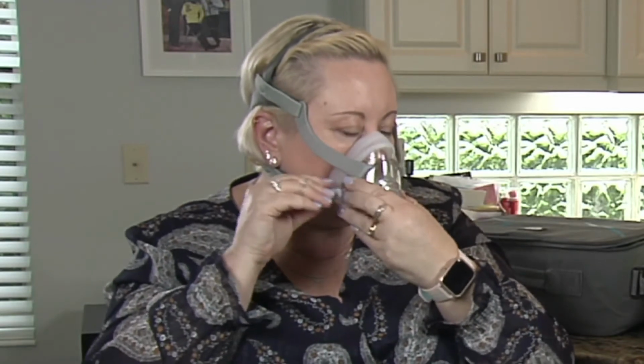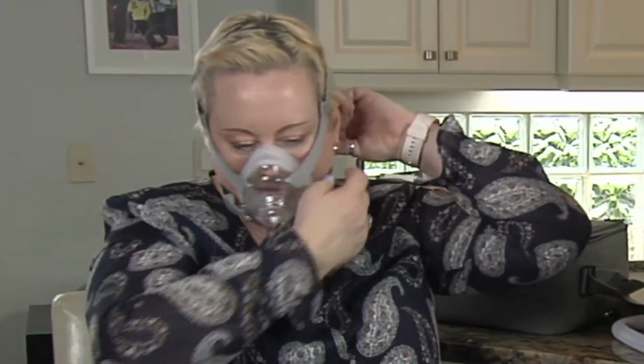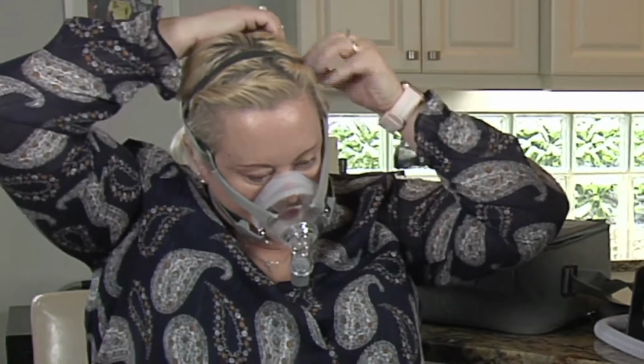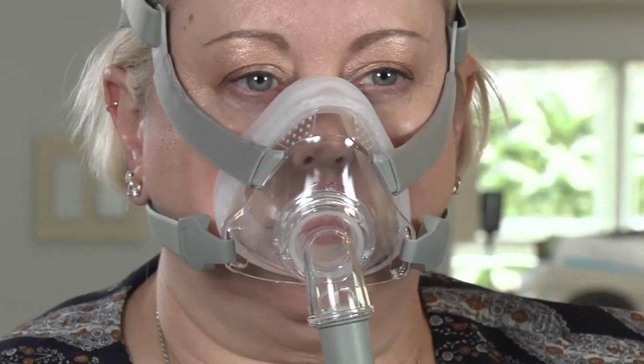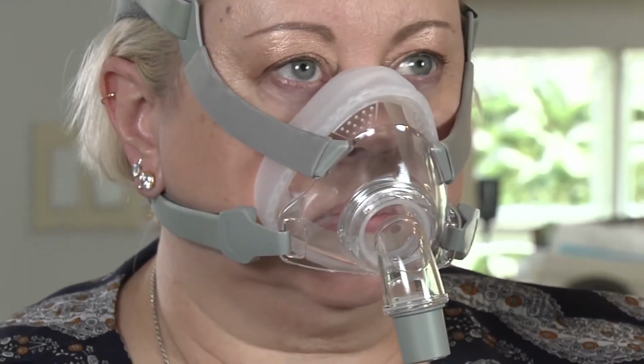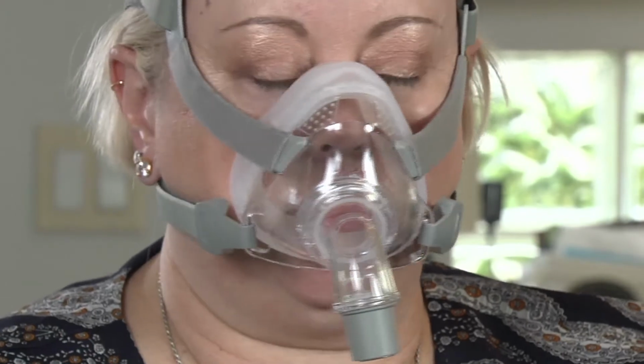Just a little bit more to the front. Go ahead and tighten the bottom straps up a little bit. I left you some room. Do you feel any pinching or pressure points? Perfect.